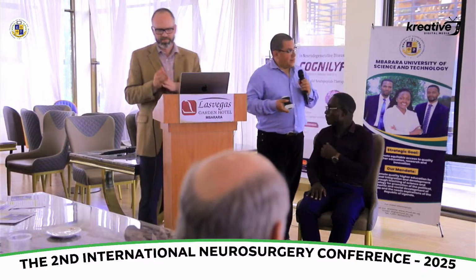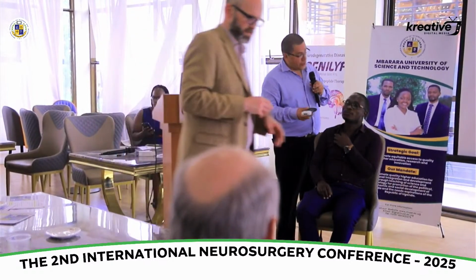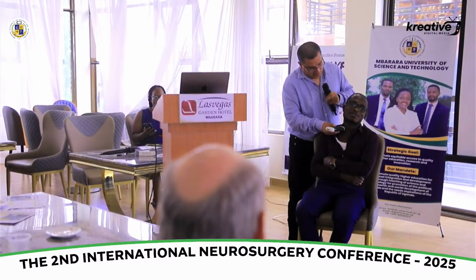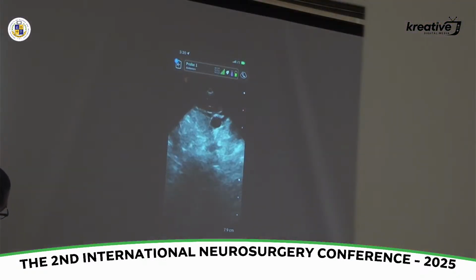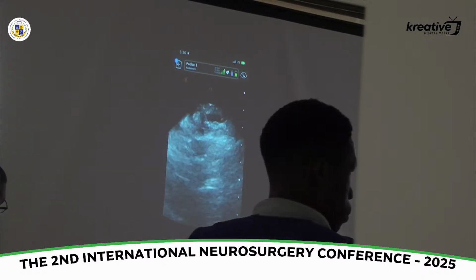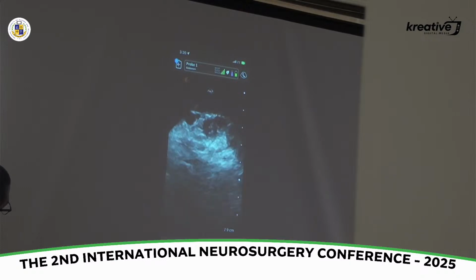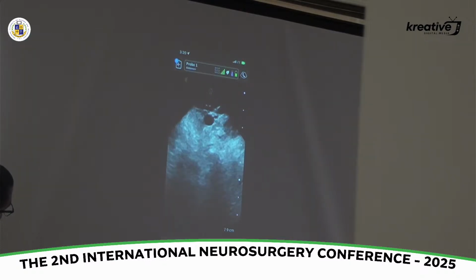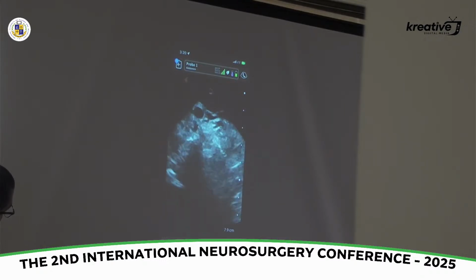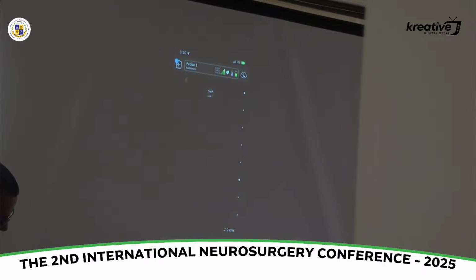All right, we're going to demonstrate a quick Doppler. Obviously, this will be the extracranial portion of it. Joseph, thanks for being my model today. So I usually start fanning from the bottom of the neck and start going up. Try to find an actual view of his ICA, and we'll follow it all the way up to the base of the skull. You can also obtain a lateral view. It seems like Joseph is alive, so that's great.